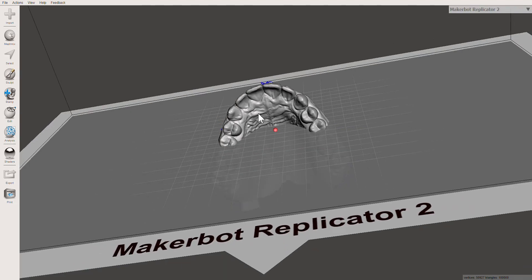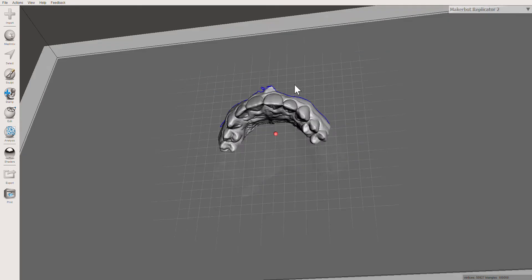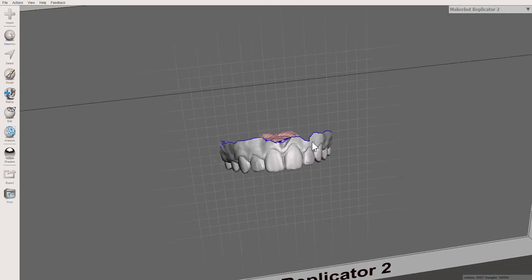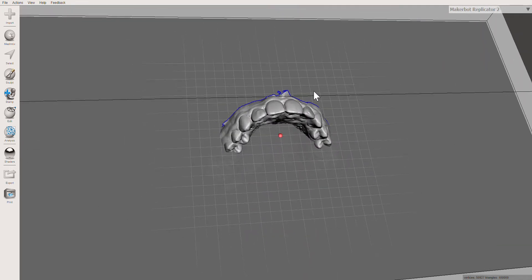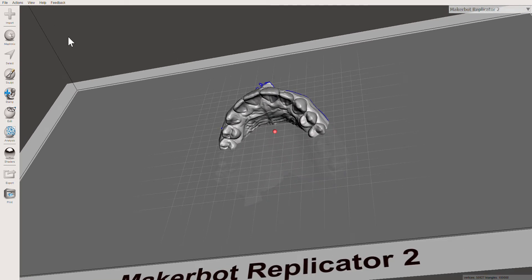Hey, it's Ivy from DOH and today I'm going to show you how to edit a model in Meshmixer. I'm using Meshmixer, which is free software you can get online and download from their website. We're going to be using it to prepare our models to be printed, so I've imported my STL file into Meshmixer.